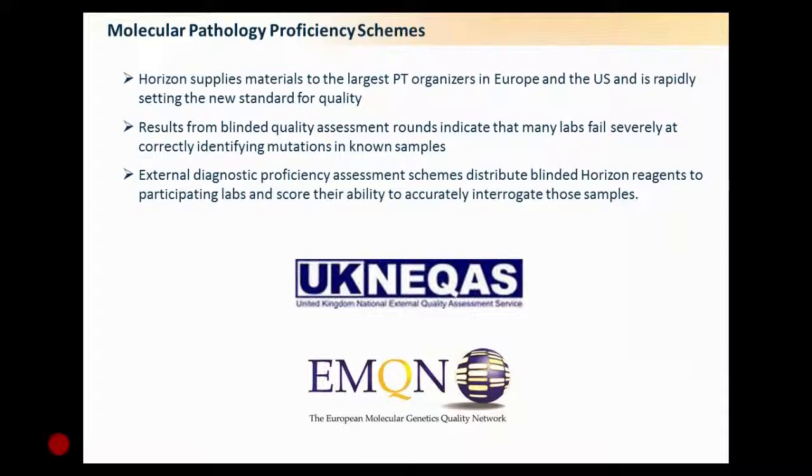Coming to the close of the webinar, we have been working very closely with all the proficiency schemes, and they have really helped push us in the direction of what is needed. Like I said, they help to show which standards are required, particularly in NGS. This is a very new field, and I don't believe there are more than 1 or 2 proficiency calls going out this year, because it's relatively novel.